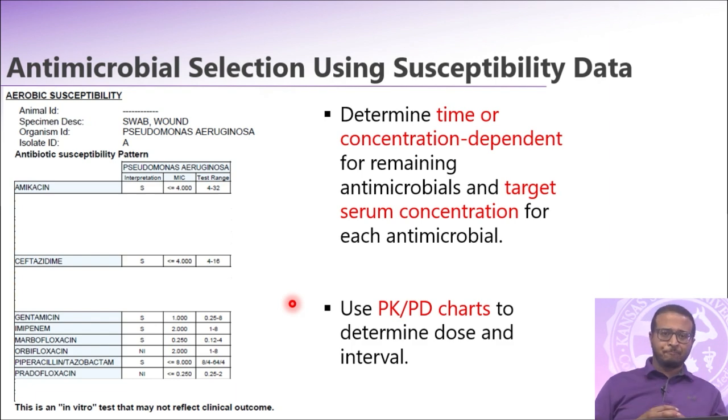If this specific antimicrobial will make it to the target tissue and allow it to kill the bacteria. We then get to know which of those antibiotics is a time-dependent antibiotic, which one is a concentration-dependent antibiotic, and we look into the target serum concentration.